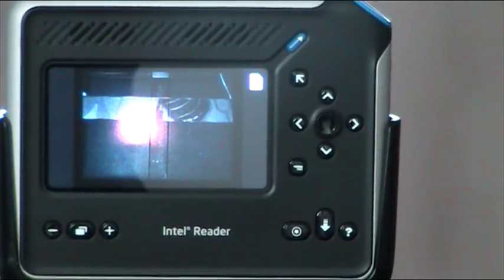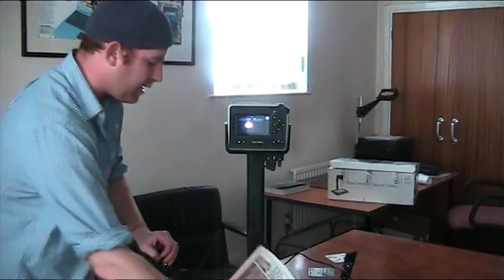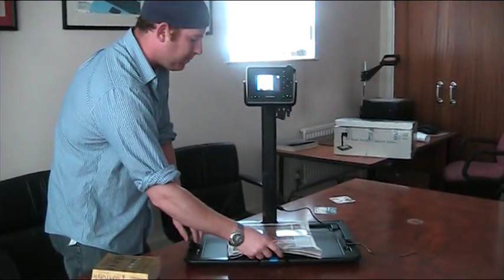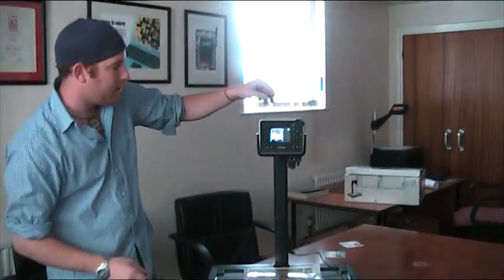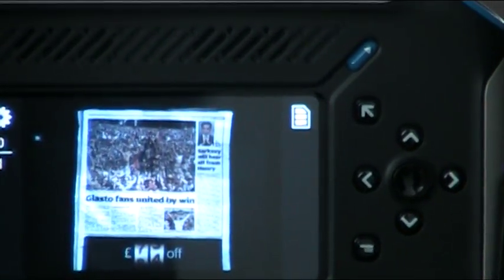First thing we're going to try is a newspaper. We'll go ahead and lift this up and stick it in. You can see the newspaper shows up right here, and then we're going to press shoot to capture an image. Focusing... it's about a minute to go through all the information, which you can find in the recent items.